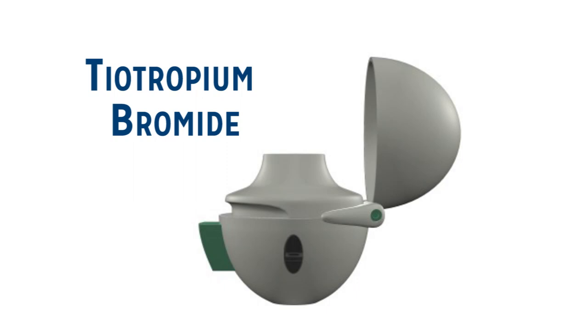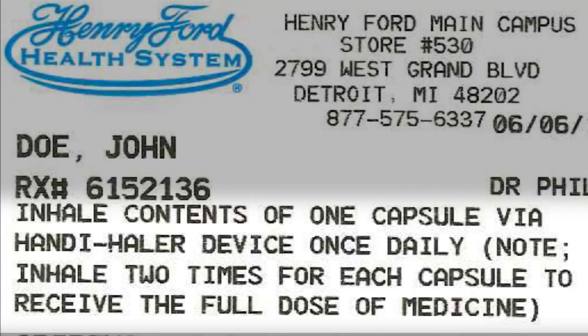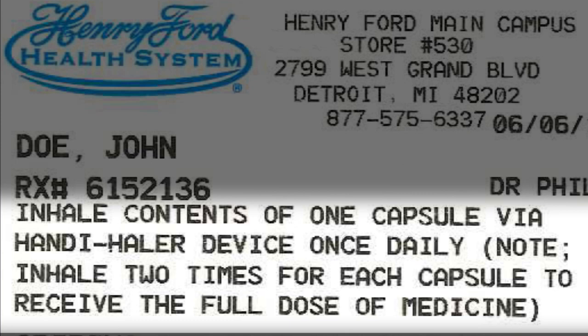The inhaler prescribed contains the drug tiotropium bromide. Your inhaler will have the same drug but may be a different color than shown in this video. This inhaler is used to manage your COPD. The inhaler prescribed is used once a day and should be used around the same time each day. This inhaler should not be used to treat sudden symptoms of COPD and will not replace the need for a rescue inhaler.